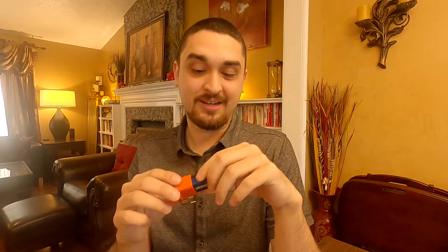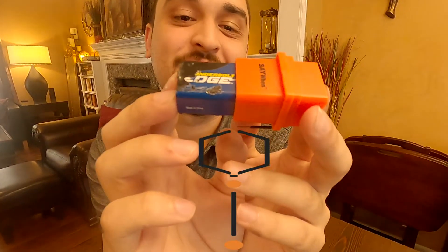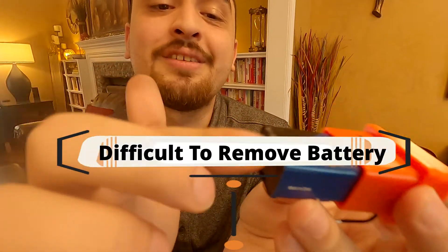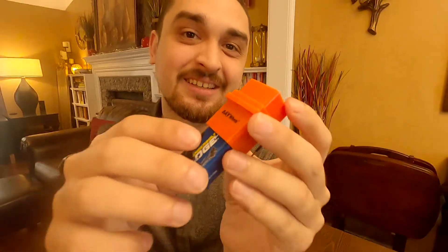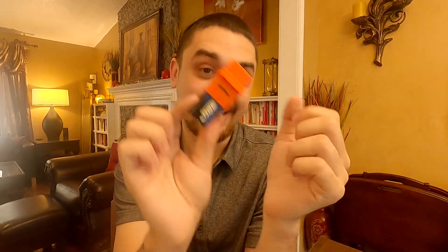The other problem you may encounter — that Chandra and I have had on one of these — is that once the battery is inside and works, it is ridiculously hard to get out. You can see I have scarred and bent this battery trying to get it back out of a demo model.